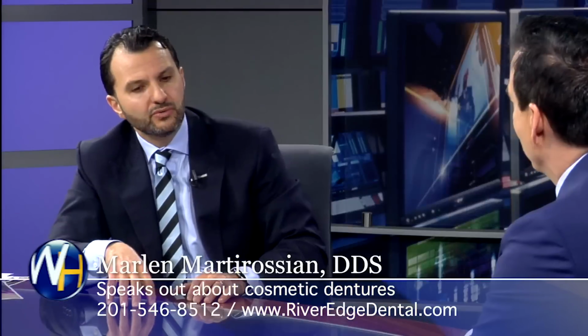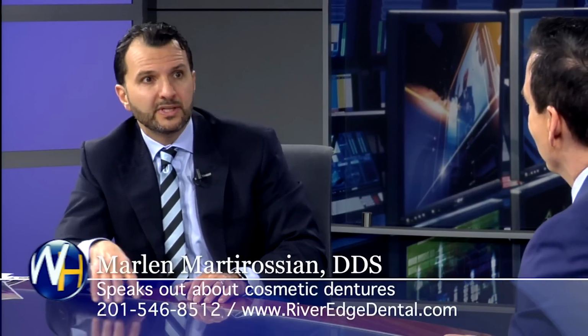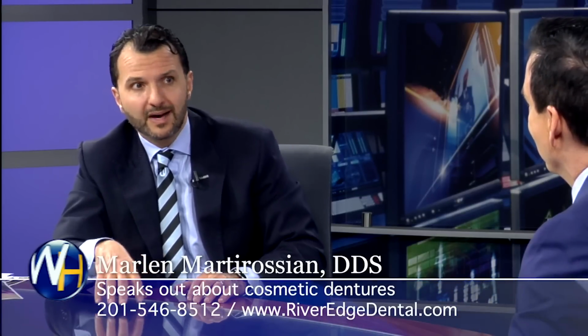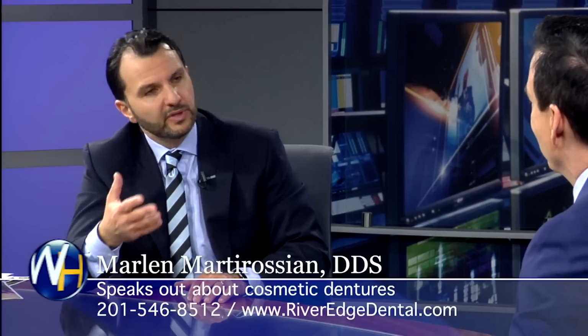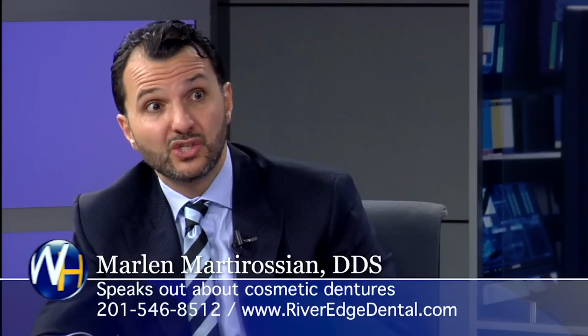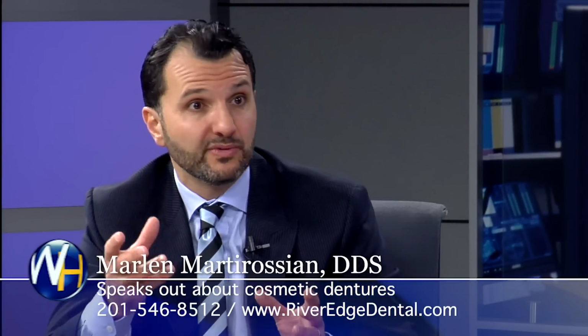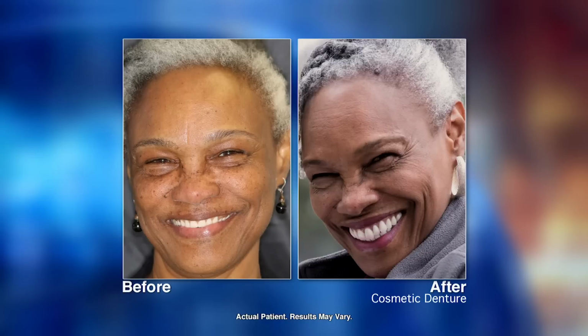By the way, what I wanted to also touch on is the digital smile design. So this is something that we've been doing for the last couple of years. So we put the picture on the screen, and together with the patient, sitting next to the patient, we start designing teeth. We start designing the shape of the teeth, the color of the teeth. Those dentures get customized. So they actually pick and say, I like that. Yes. When they see it on the computer.